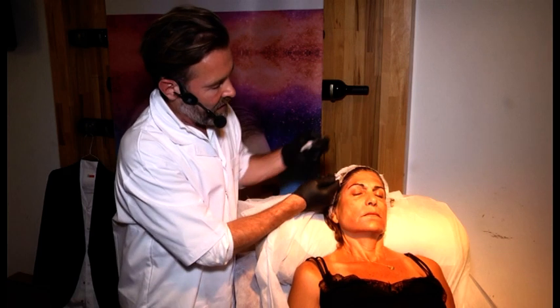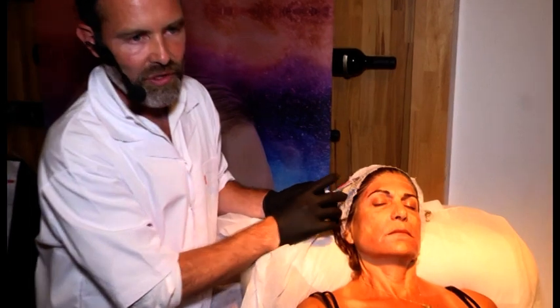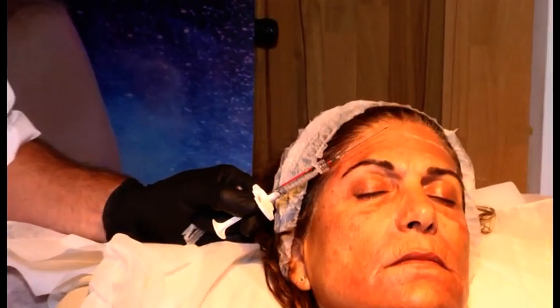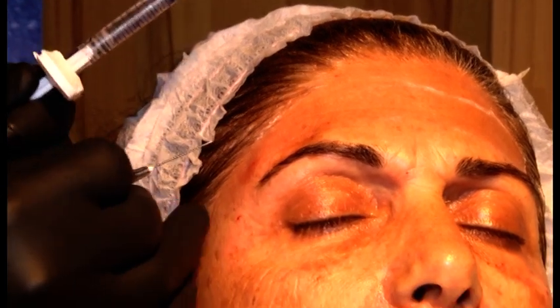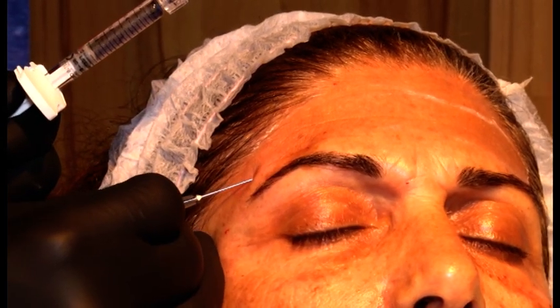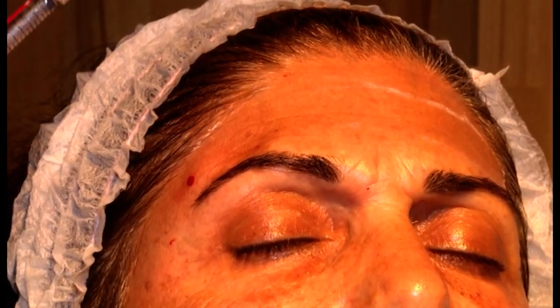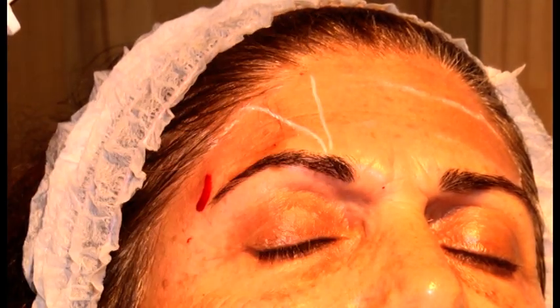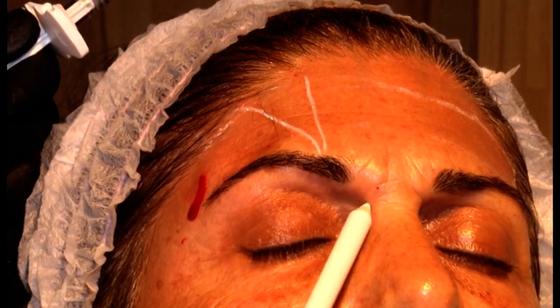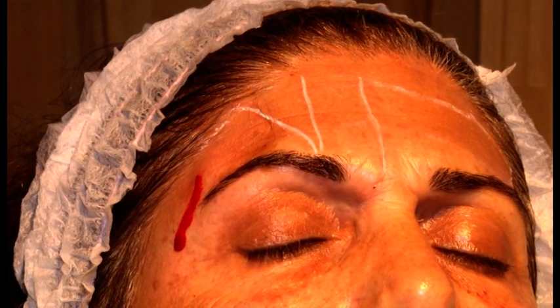And the needle. So the same reason, a 22 gauge cannula, safety precaution, because it enters into blood vessels much less easily. Thank you. And remember, from the supraorbital foramen, there are the branches of the supraorbital artery. From the supratrochlear foramen, there's a supratrochlear arteries going up.